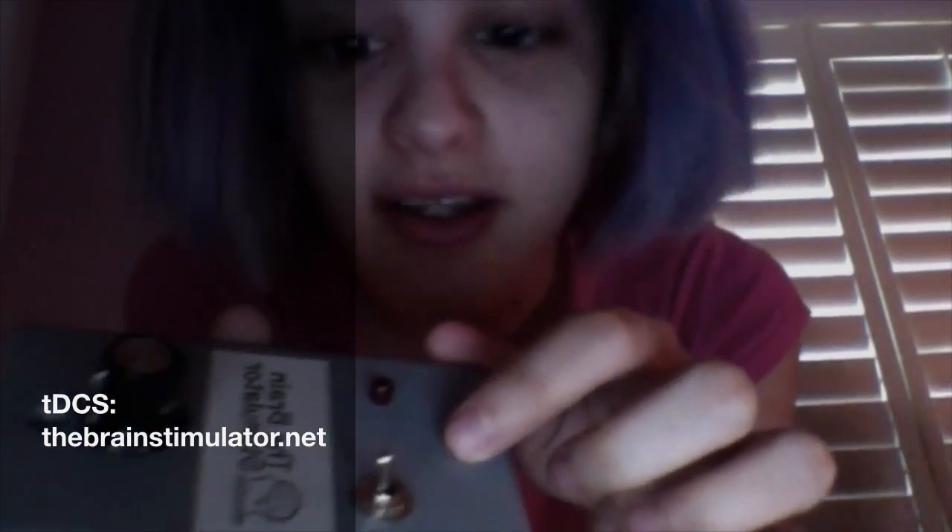Hey, so I just got the brain stimulator. I just unscrewed the little thingies here, and I have to install a battery, and I just went, oh my god, how do I do that? So I'm going to attempt to do that now.